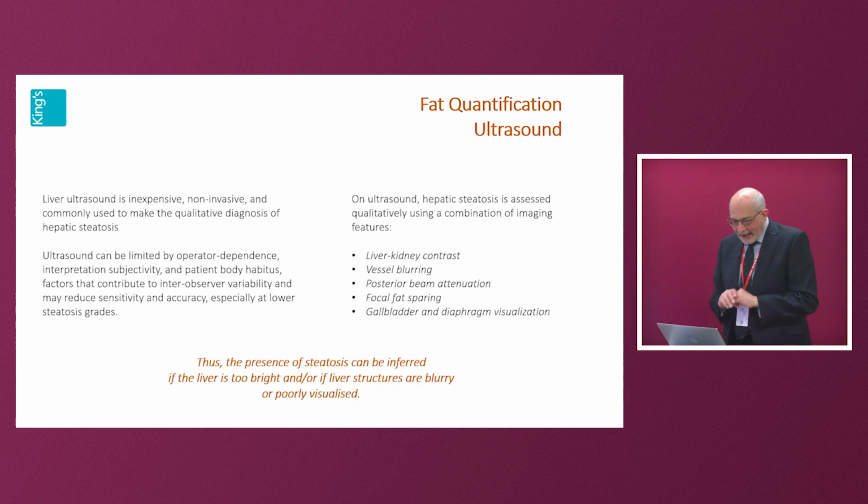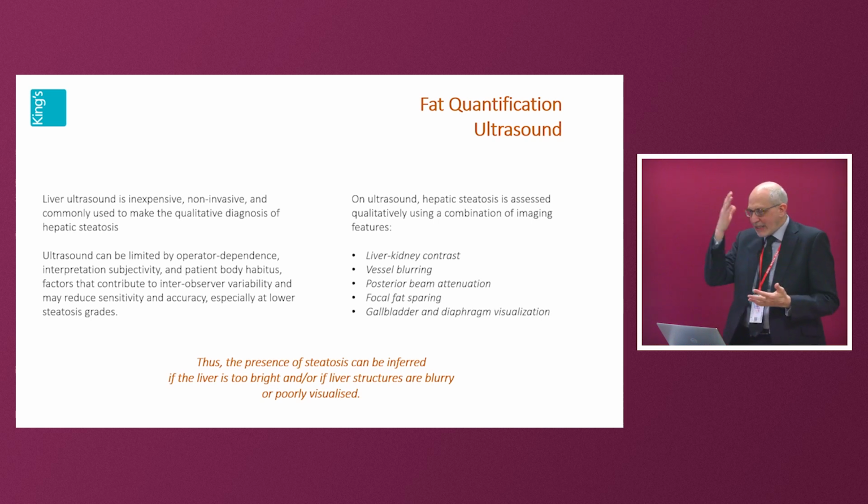So everyone is familiar with how ultrasound is inexpensive and non-invasive, and you can do that qualitative, subjective measurement. But it's so operator dependent. It changes with the patient's body habitus, and there's so much difference between what different people look at and tell you is good and what is not. And how do you do this on just the base ultrasound? Well, most of you just eyeball it and decide.